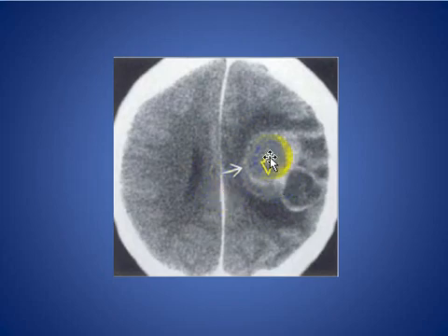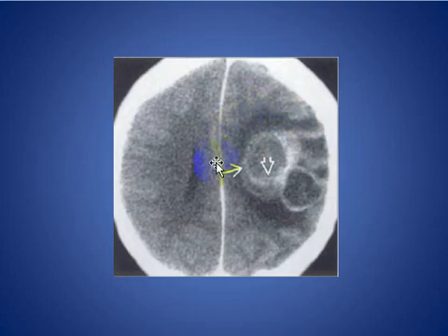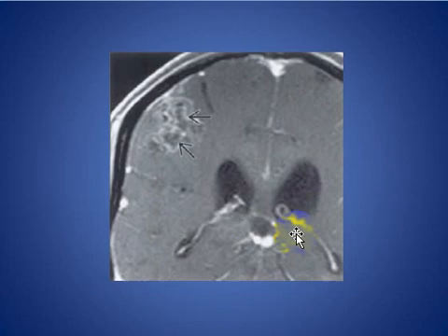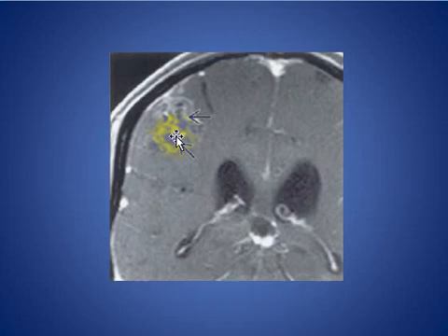AVM accounts for about 1-2% of lesions and can mimic a tumor, often seen with vasogenic edema. Here is a coronal MRI with a partially thrombosed AV malformation with flow voids noted in the enhancing area.